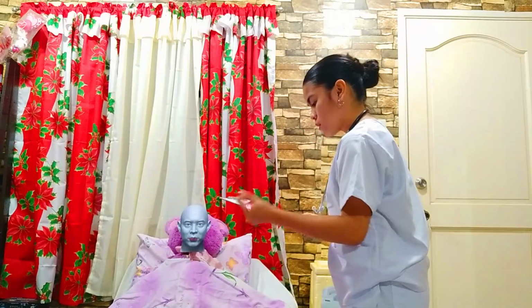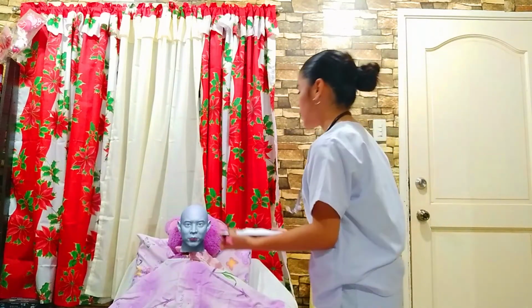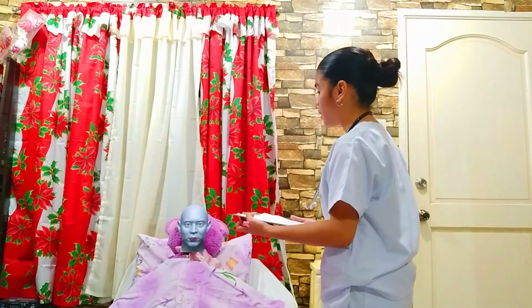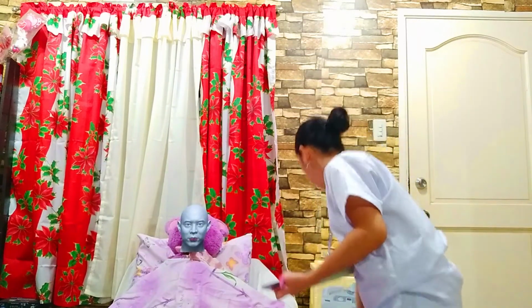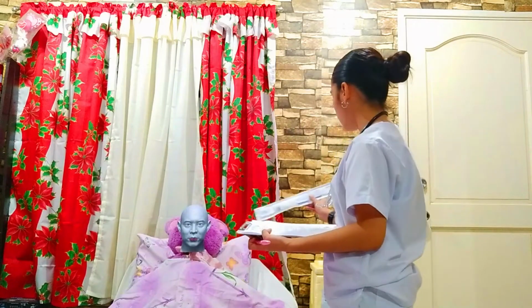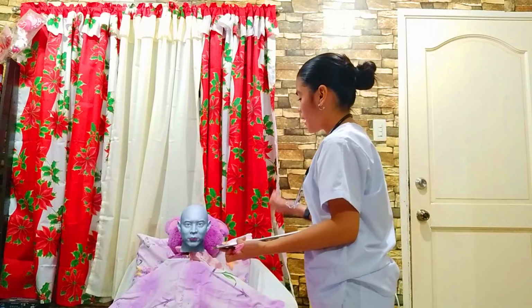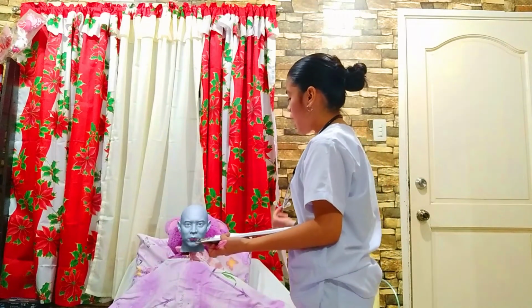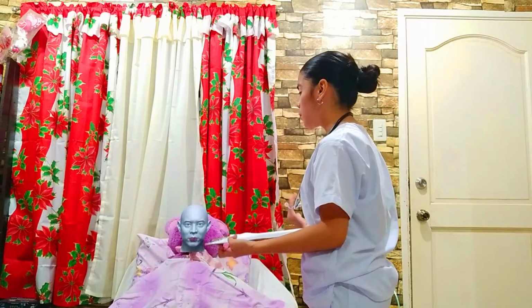Okay. So today po, sir, as we are implementing the oropharyngeal and nasopharyngeal suctioning procedure, I have here the suction catheter, and we need to insert it in your nasal cavity to your pharynx and into your oral cavity to your pharynx po to complete the procedure.